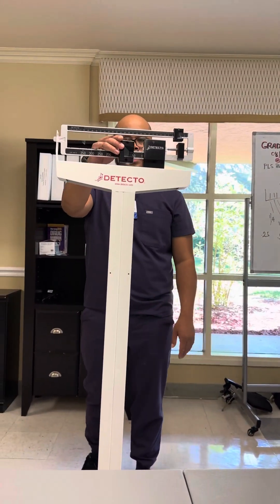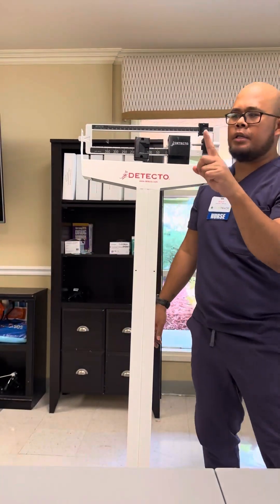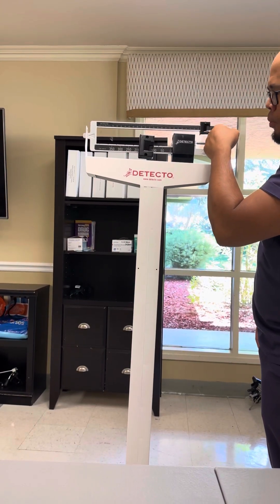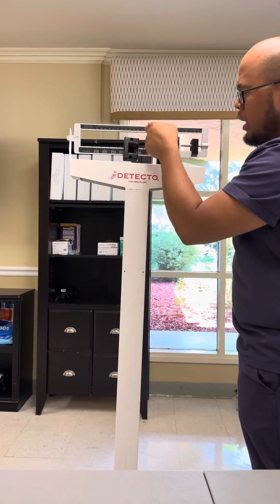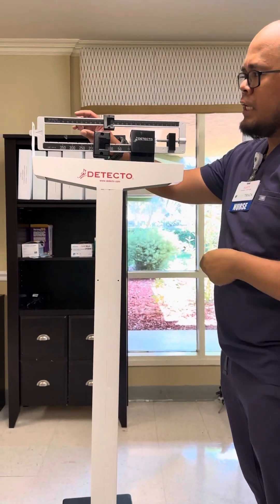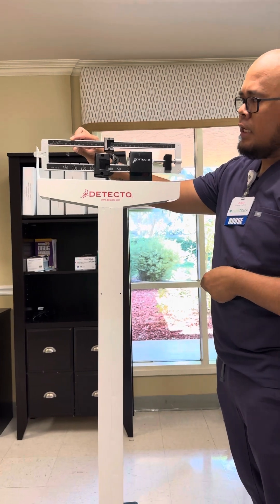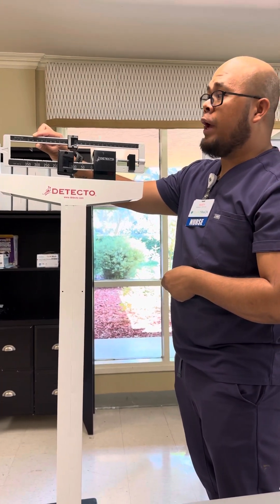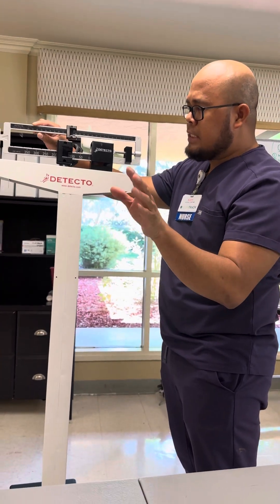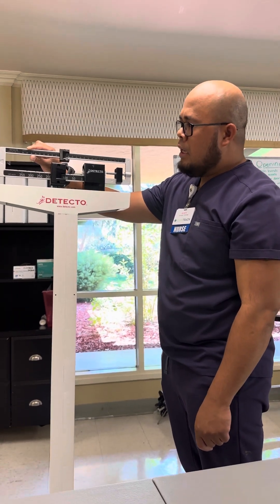So this is it right here. First, move it to 100, and then use your pointing finger right here underneath. You don't want to do it any other way. So pointing finger right there. When the weighing scale stops and this one goes to the middle, that indicates the patient's weight. If it's touching the rod, that's not the patient's weight — it should be in the middle.